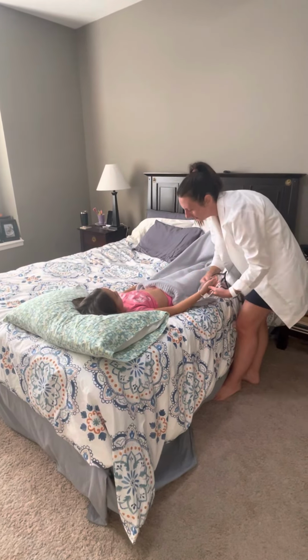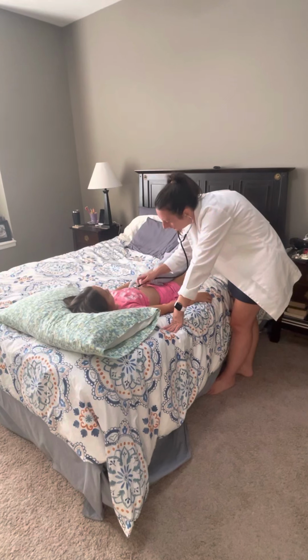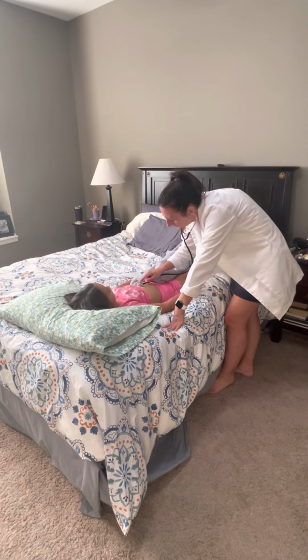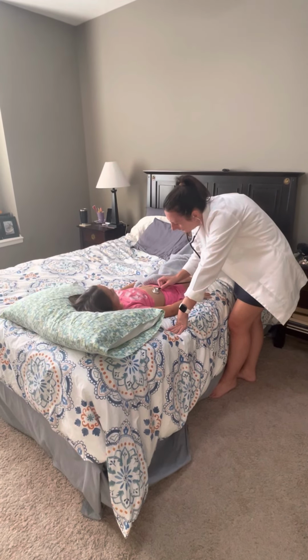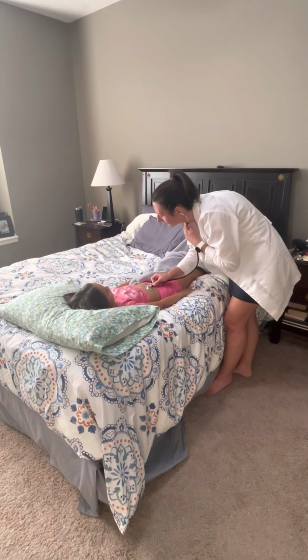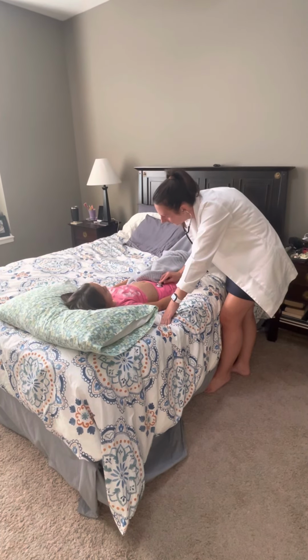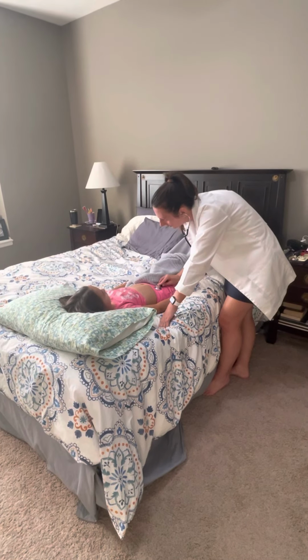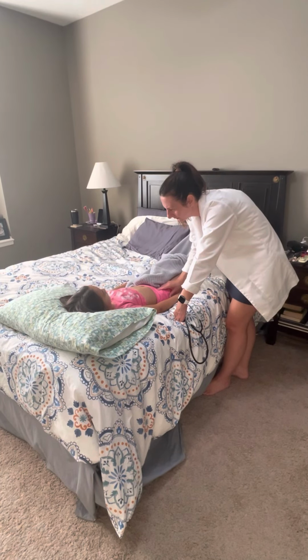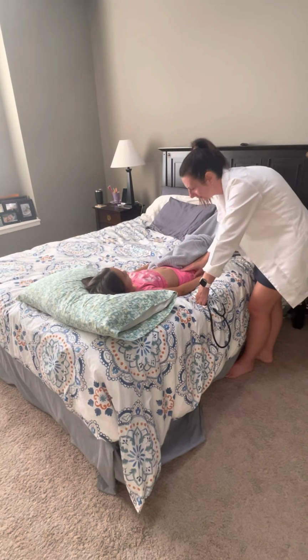So then I'm going to listen to her aortic, listening for bruits, like I said already. Iliac. Femoral. Again, feeling any bruits. See if I can feel your femoral. Oh yeah. Oh, good. You got a good femoral pulse. Popliteal.